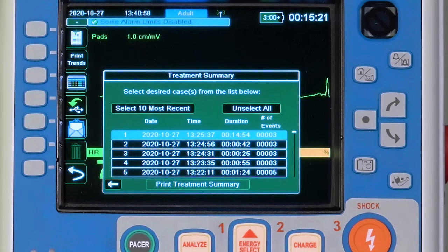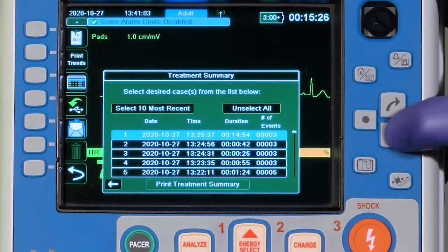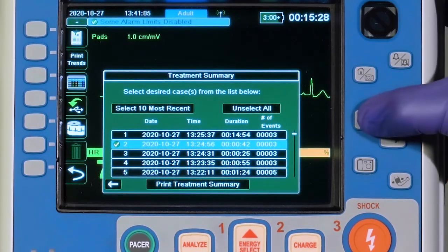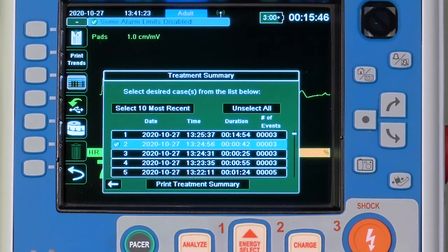The corresponding dates and times are also listed. Highlight the desired case and press the Select button. A green checkmark will appear next to the selected case.